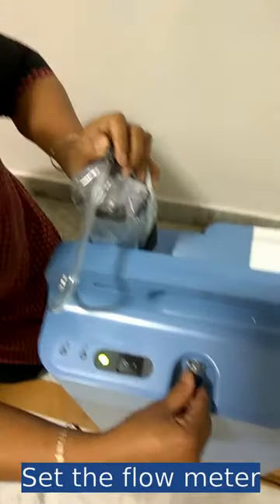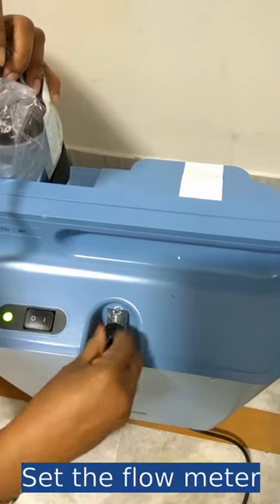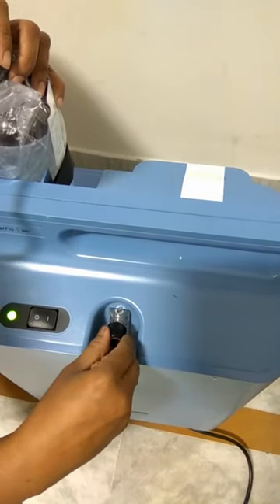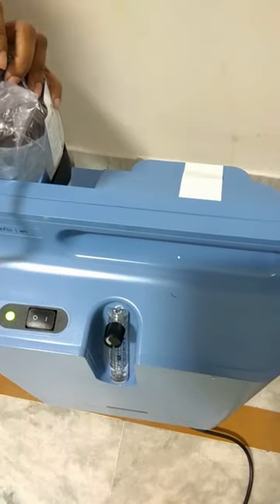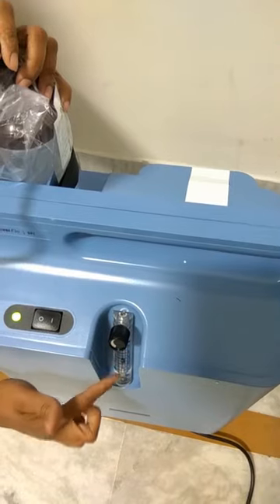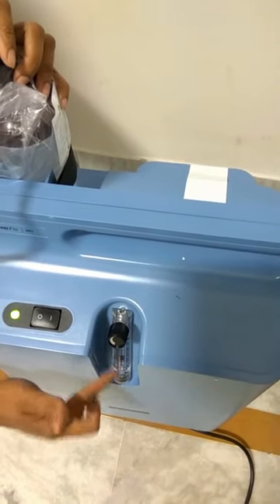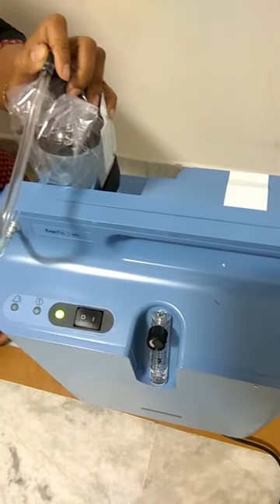Then you have to set the flow meter — it goes from 0 to 5. I am currently putting it to 2. You have to adjust the flow meter; whichever level is comfortable for you, you need to adjust this. And that's it — you are good to go.